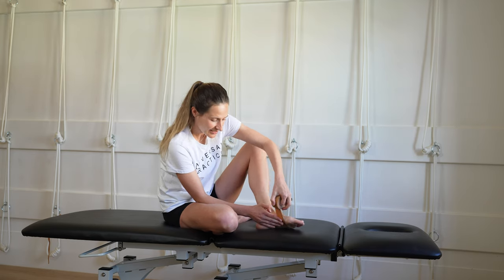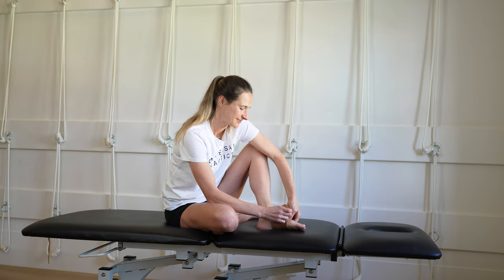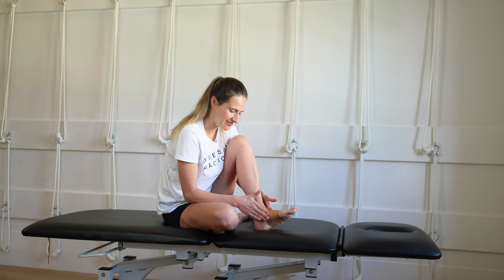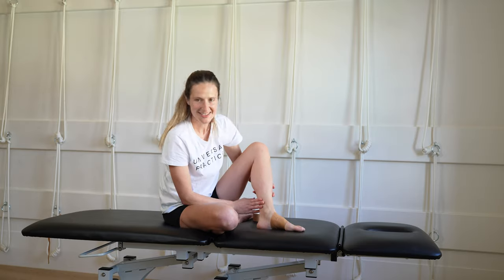Once the tape is on, give it a rub so that the adhesion is greater. And then you're done. Thank you.